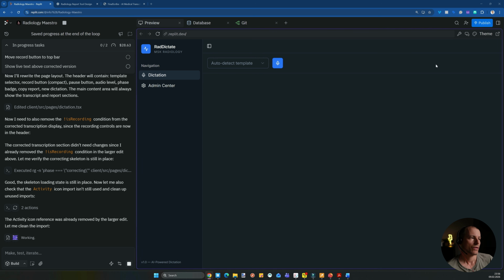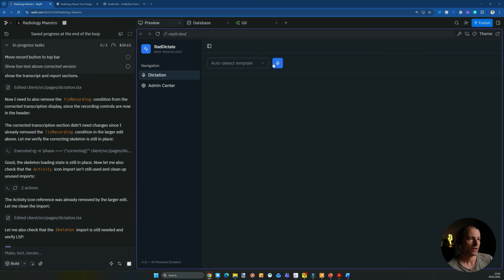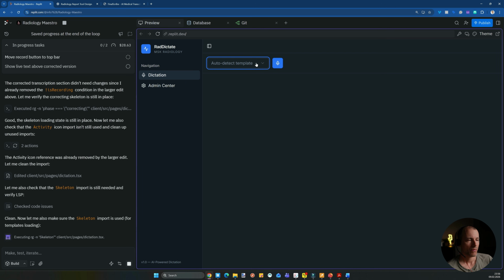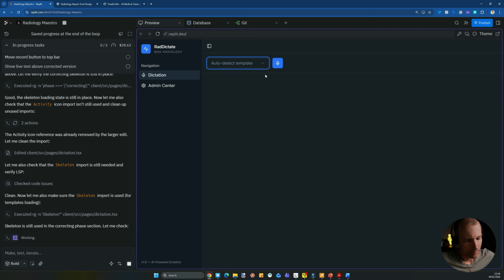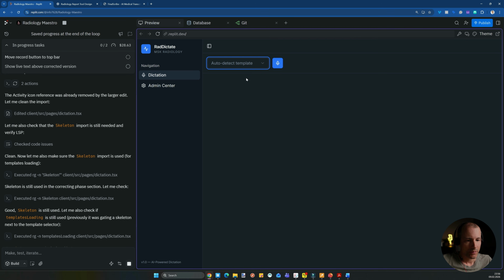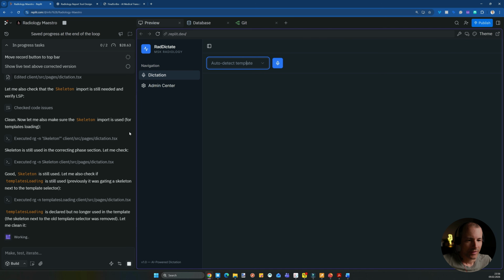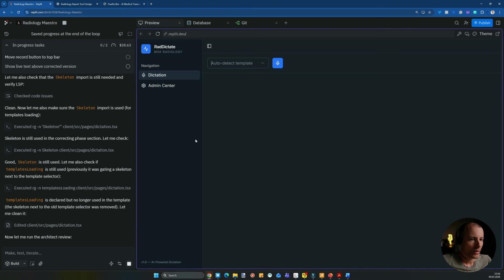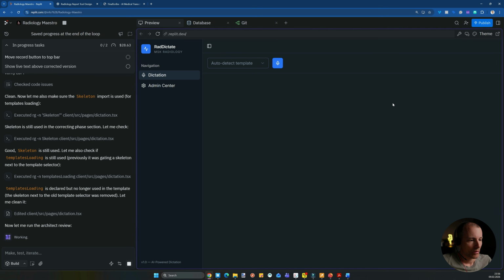I figured it's easier to have just one page. That's why the dictation button is now here on the same page. The selector here is there. Eventually, the idea would be to remove it or have the template selection only being applied after the transcript has been corrected. No, but this is something I don't need to figure out, to be honest. And let's see what else. It's now generating complete reports even if there is no template. So that was an important addition. Otherwise, it's not flexible enough.